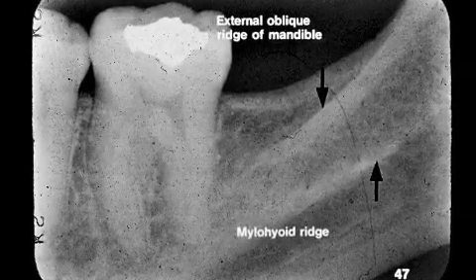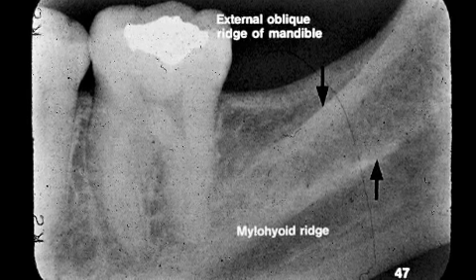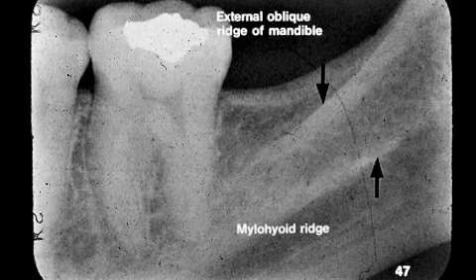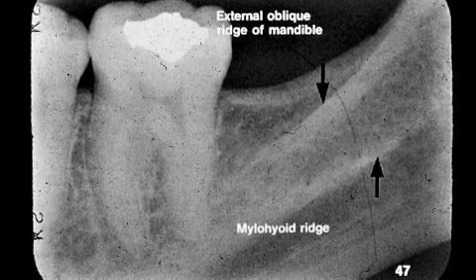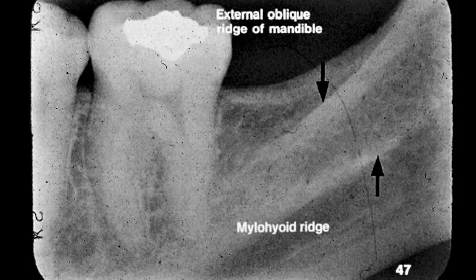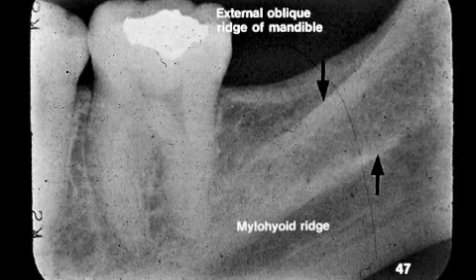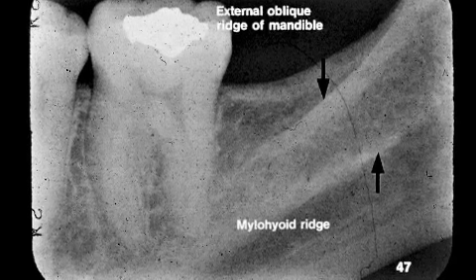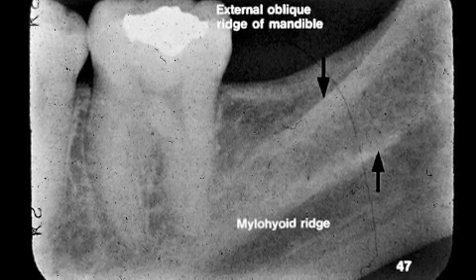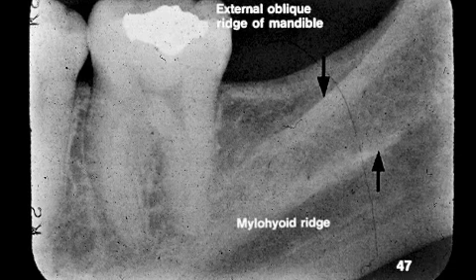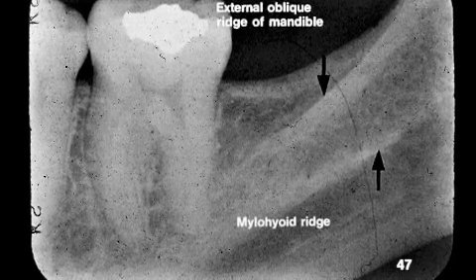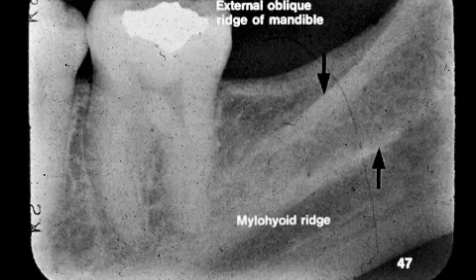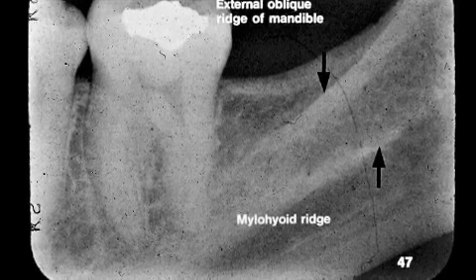Two radiopaque landmarks, the external oblique and the myelohyoid ridge — in dental radiography also called the internal oblique line — are shown. The external oblique is always superior to, or above, the myelohyoid ridge. Sometimes we only see one of these, and if we see one, it is most likely the external oblique ridge.